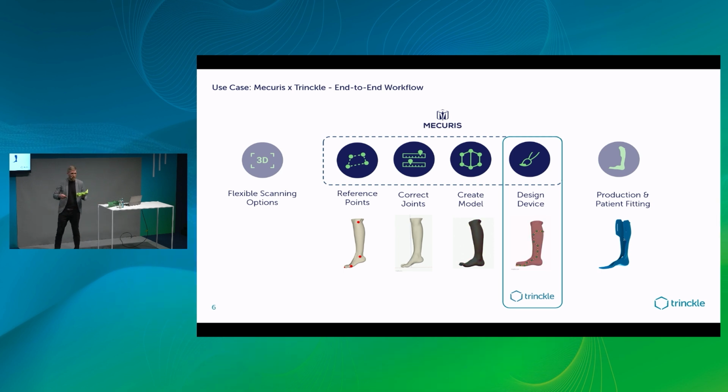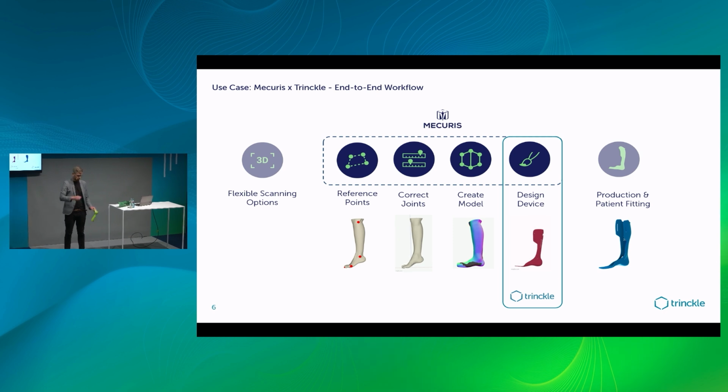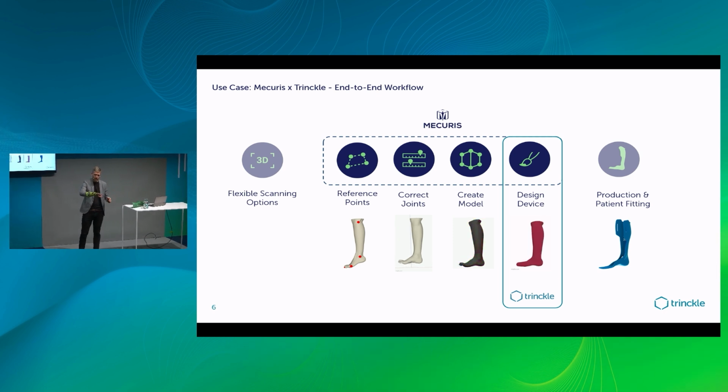What does the orthopedician do in here? First of all, he starts with a scan. So this is not my one, so it does not fit perfectly, but to explain this a little bit. So we have the functional form of my hand, of my arm, and the first thing that the orthopedician is doing, he will create this cut line, this trim line here, and there he has the free choice to design whatever design or device is needed.